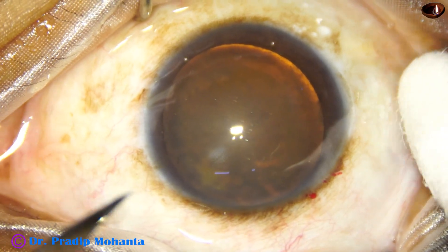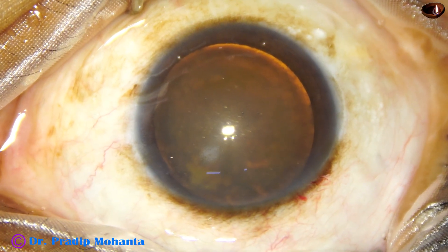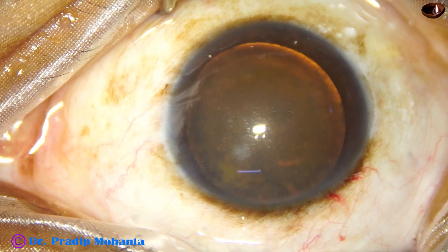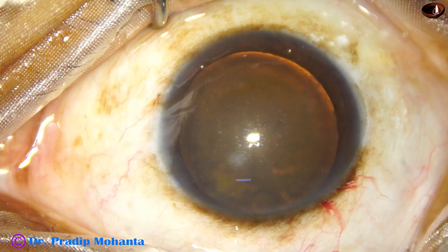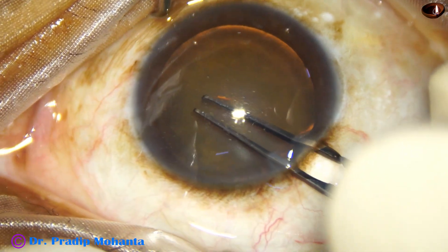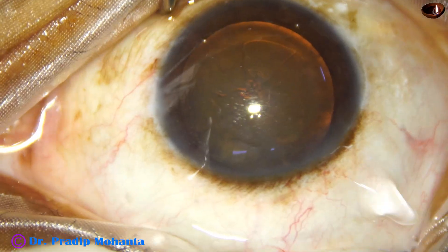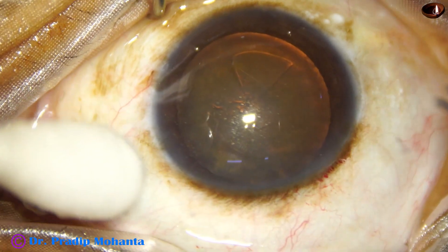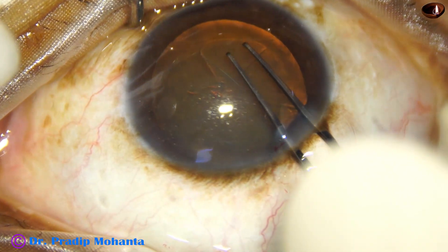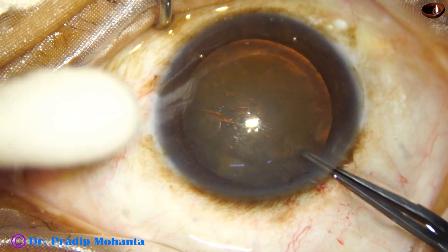By this time the main incision has been made. The anterior chamber has been filled up with viscoelastic substance. A side port is made on the left side of the wound about three clock hours away. Now capsulorrhexis is to be done. I take a utrata forceps, make a puncture at the center of the anterior capsule, go to the left side, and guide this tag all around. At this time the anterior chamber became shallow. It was a small area so I just finished it off.